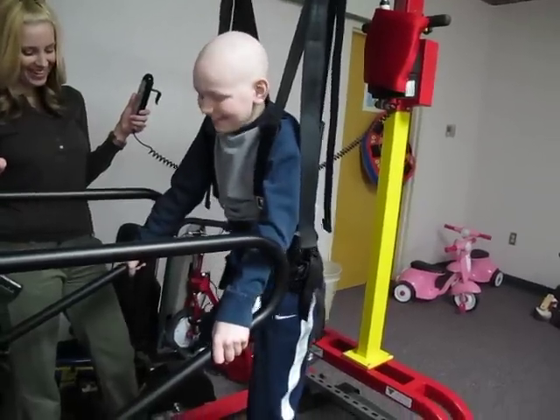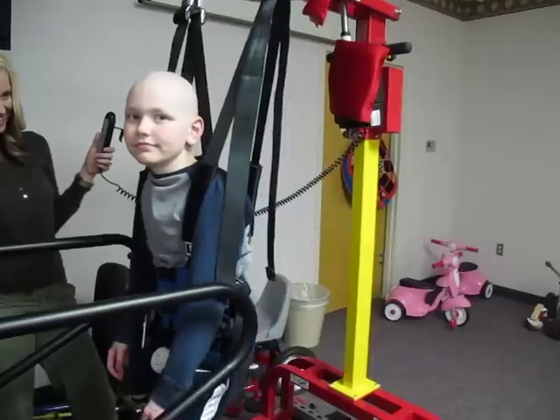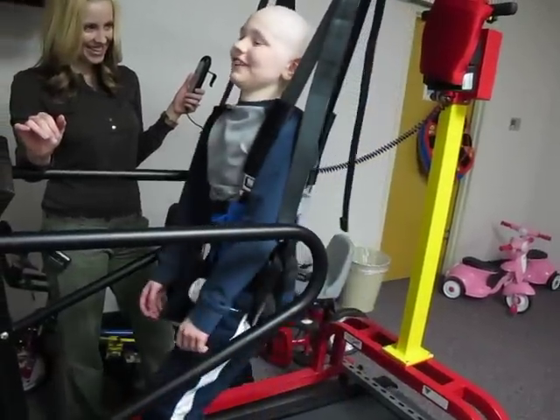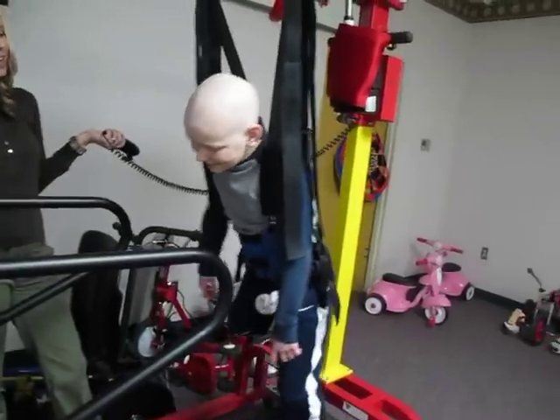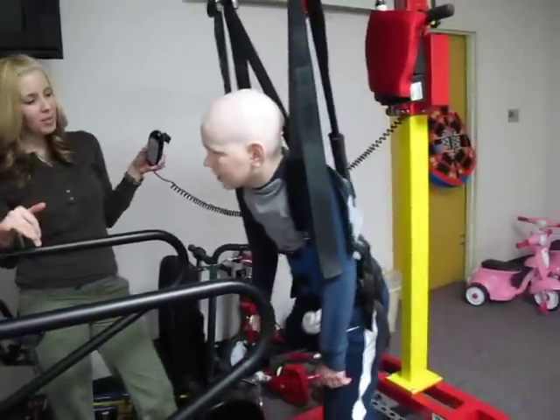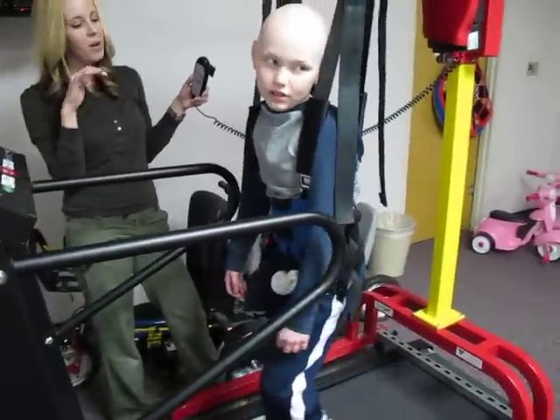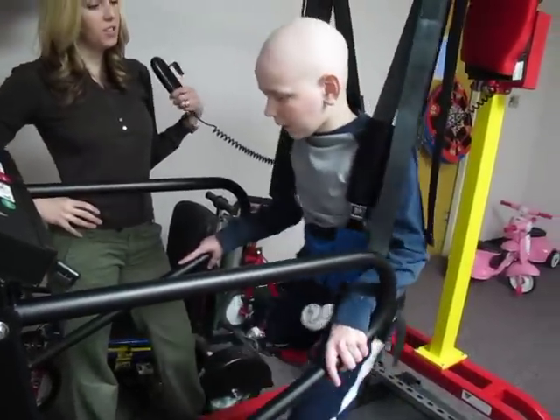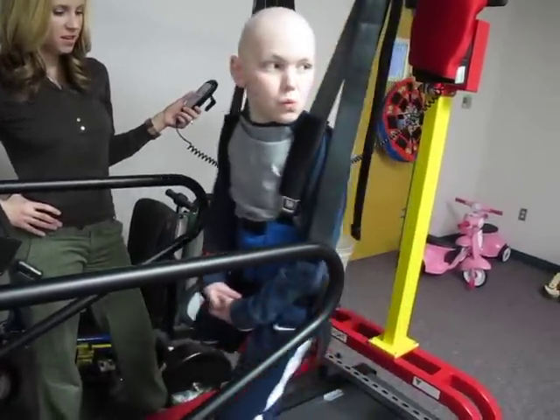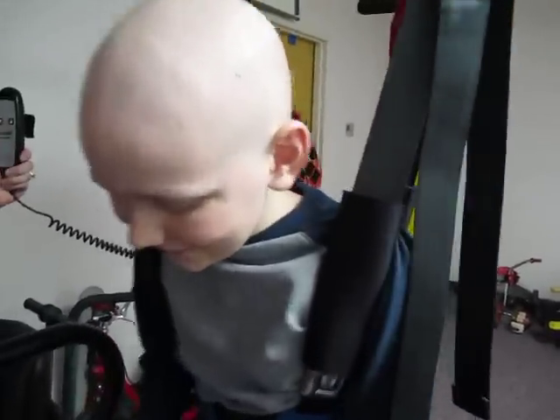Put your foot on there. There you go. Do you remember what it feels like to walk? No. It's different, isn't it? Well, this is more like a fun swing. This is just to get you understanding — and then we get breaks too. After you work on it, I'll raise you up and let you fly for a second and put you back down. So this helps you understand how the equipment works too. I want you to kind of feel what that harness feels like because it just takes getting used to it. I put this on myself because it just feels different. You're working really hard right now. Let's see your smile, buddy.